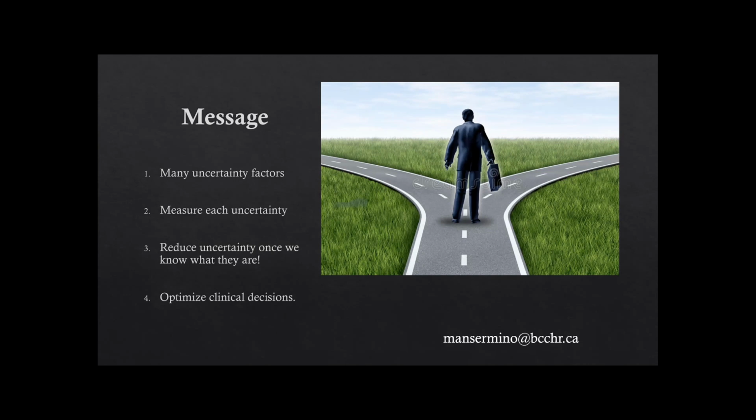For example, we can make sure that we have a higher perfusion index, or less interference in how we're actually measuring this. We can perhaps do duplicate measurements. There are other really practical things that we can actually do to try and reduce this, but we should also balance that with optimizing how we make clinical decisions.